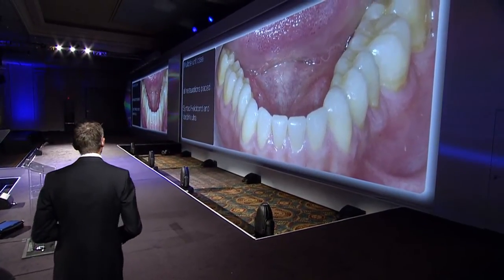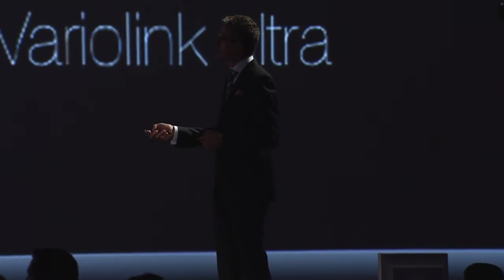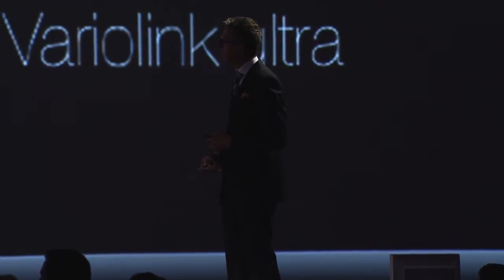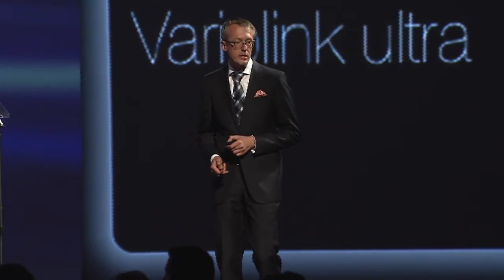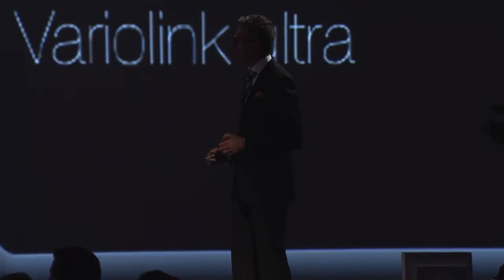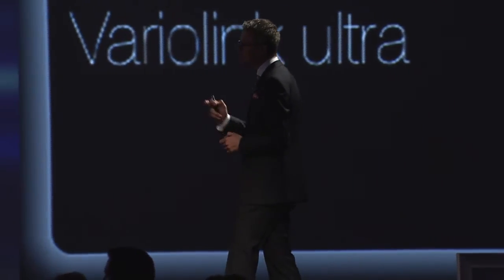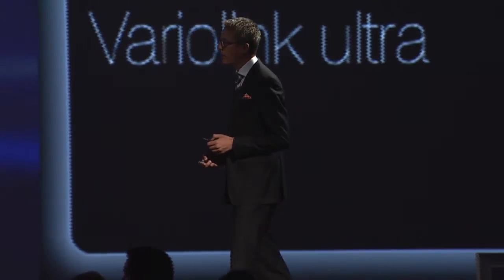Not in one appointment, in several segments, but at the chair side. The third quadrant, and finally the fourth quadrant after bonding these restorations to the preparations. So we built up the loss of tooth substance and we did the elevation of the bite using the CEREC technology.